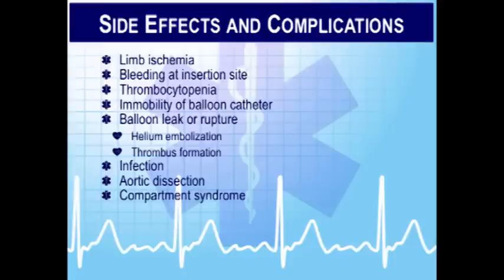When the balloons first came out, they were latex balloons and they would rupture and leave fragments of the balloon. But now, I feel bad I didn't bring it, it is almost like thick saran wrap. That's what the balloon looks like. It's clear, thick saran wrap, for lack of a better term. Infection, as you brought up, aortic dissection, and then compartment syndrome.